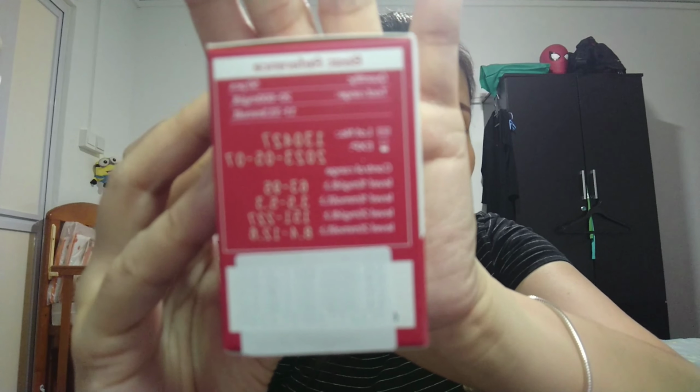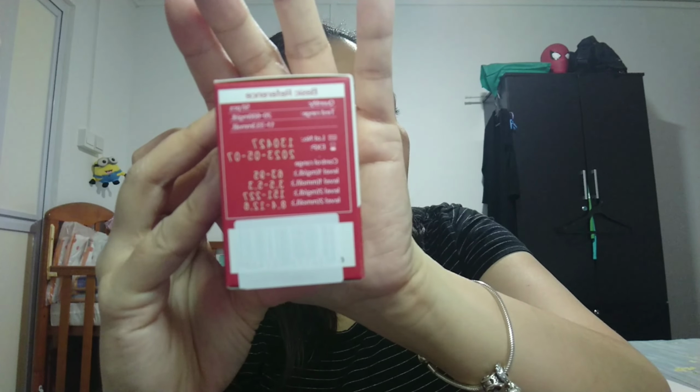When you get something from Shopee, you need to check the expiration date. So here it shows the expiration date. The expiration date will be May 7, 2023. So you check all the items. This one is 2025, and of course this one doesn't need an expiration date, unless it's broken, then you need to get a new one.